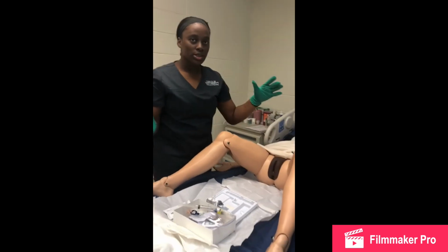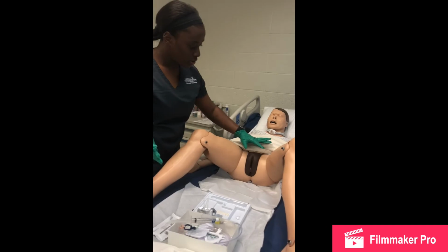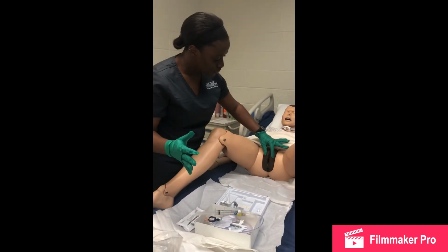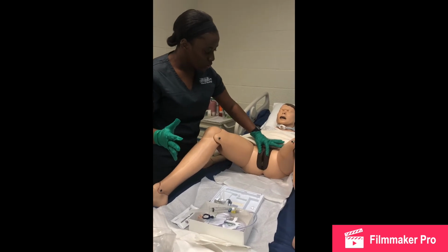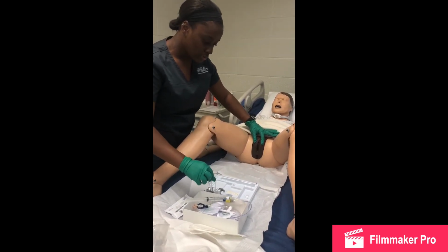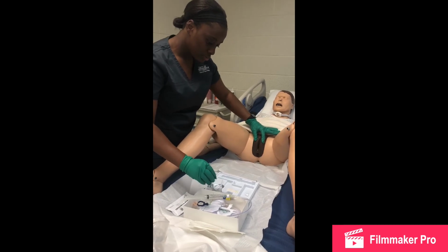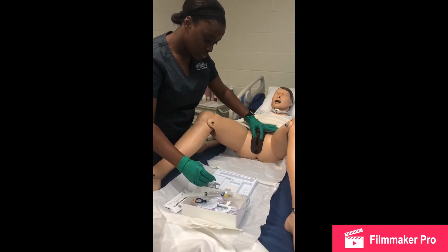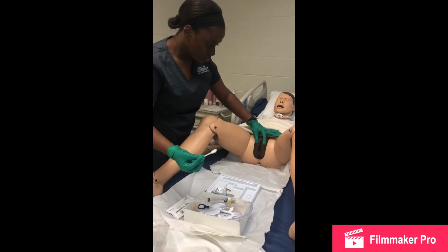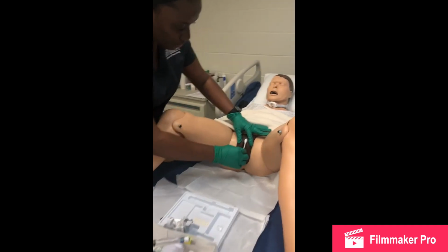So now I'm going to use my non-dominant hand and make sure that I clean my patient properly. So I'm going to touch my patient on her perineum area and start cleaning. Start from the outside.